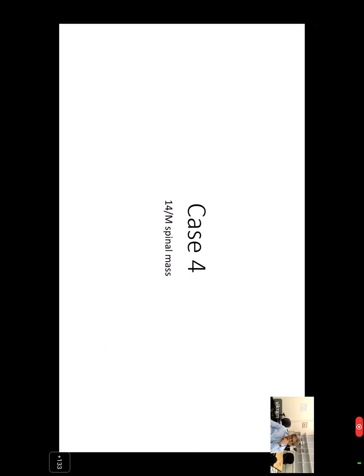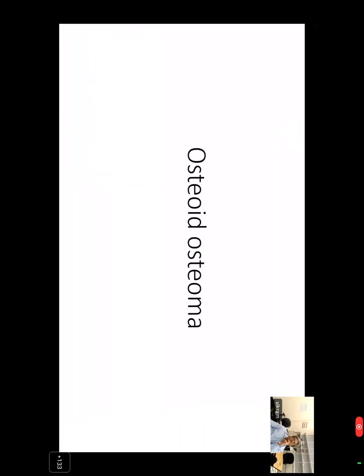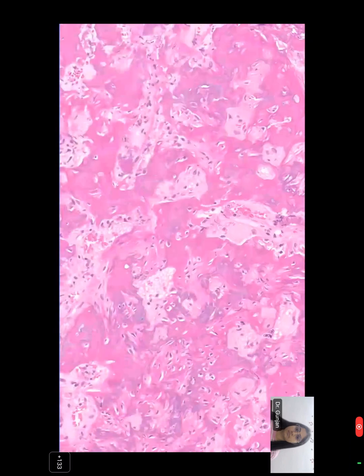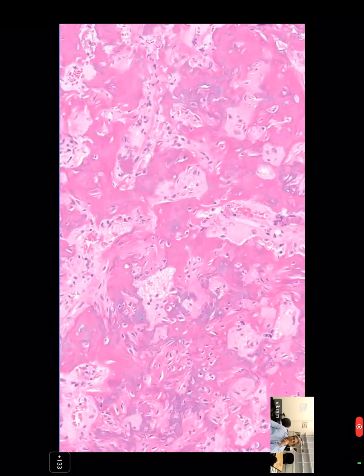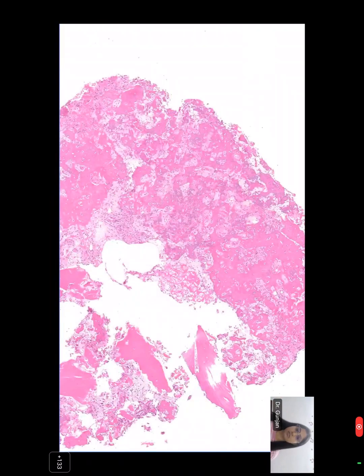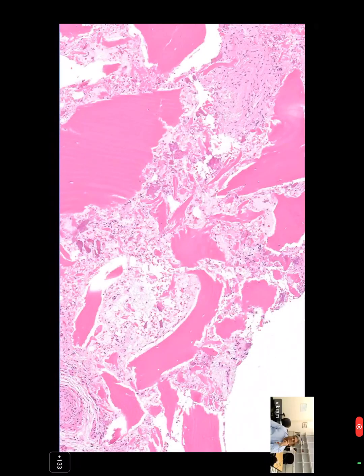Let's talk about case four. Sir, I have a doubt. Yes, please go ahead. In one of the images that was there, in which we talked about the overcalcification, the last image, I think... This one? Escape beyond that. Stop me when you see it. Not this, the first image? This one, so this one only.